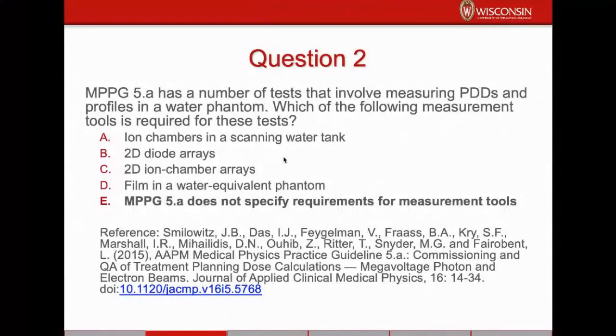And so, when you're thinking about performing these tests on a TomoTherapy or a Halcyon or another device that doesn't accommodate a 3D water tank, this particular practice guideline is designed to be very versatile. And so, with that in mind, the authors said, use whatever devices will let you do these tests, and just make sure that you get the types of information that we're requesting. But if you come up with a reasonable way to acquire that information that doesn't involve a water tank, by all means, use that.